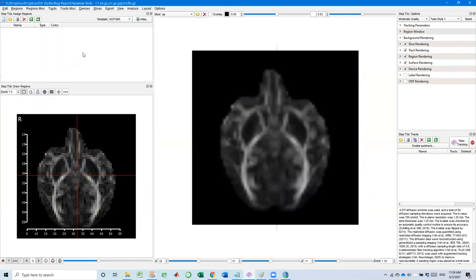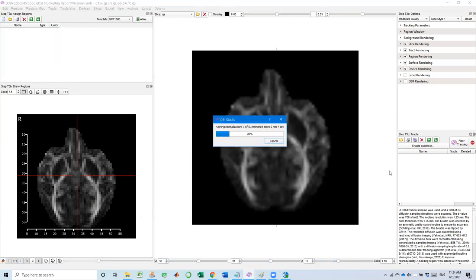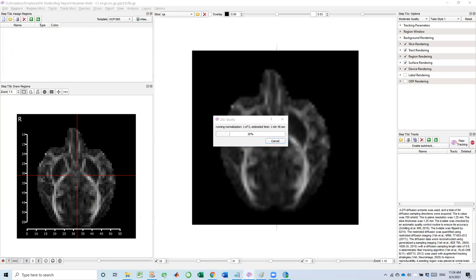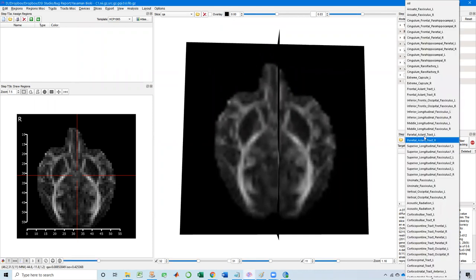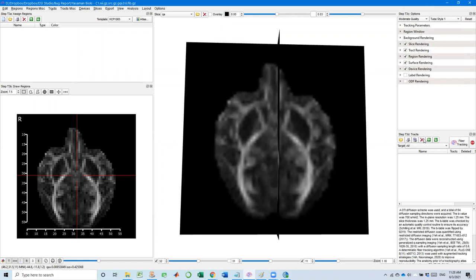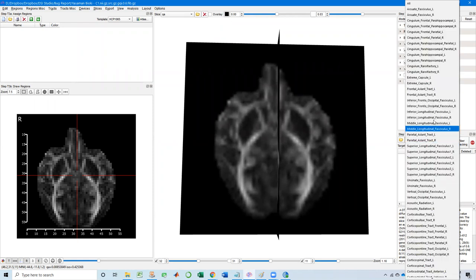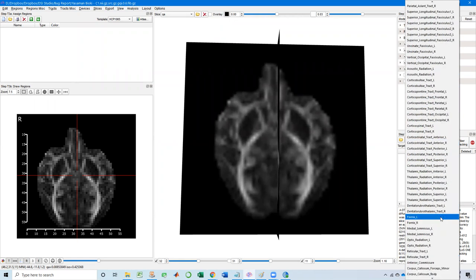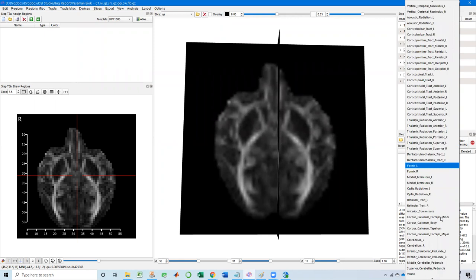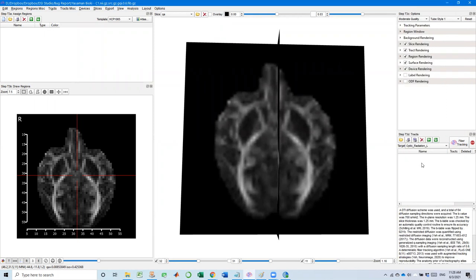Great. So let's remove all those regions. And on the right, click enable auto track. So here, once we click enable auto track, DSI Studio will run another normalization. But this time, instead of bringing subject space brain into template space, it's bringing template atlas back into the subject space. So it's kind of another way around. And this will take another like one or two minutes. I will fast forward. So right now, the normalization is finished. And we could now select different targets to map. So for monkey brain, I would first go with optic radiation. The reason is, compared with human brain and other species, monkey brain always has a huge optic radiation. So if this failed, then probably the other tracks will have no chance.